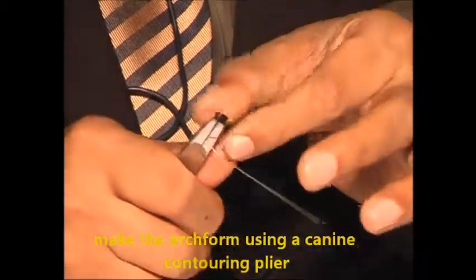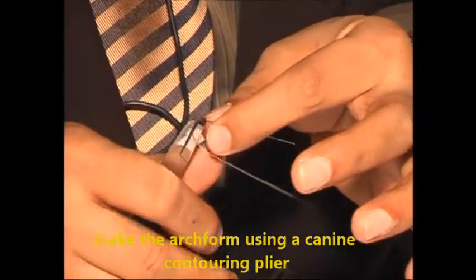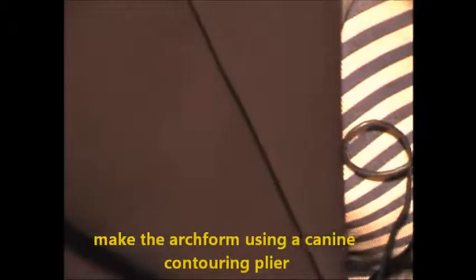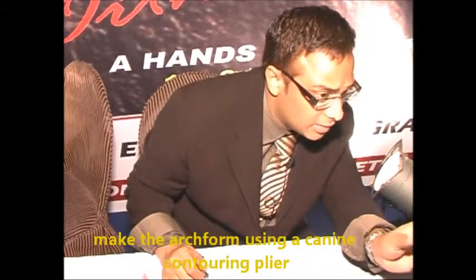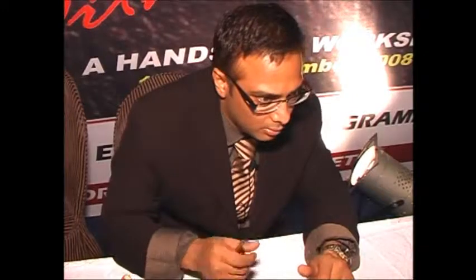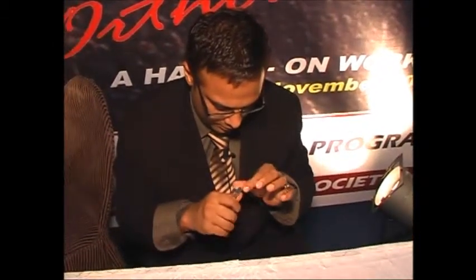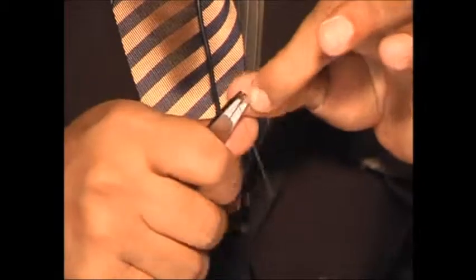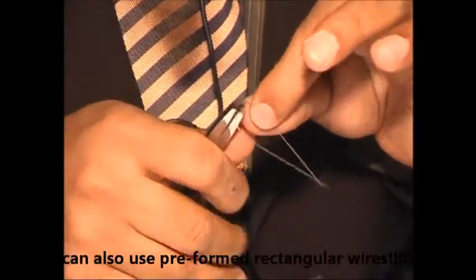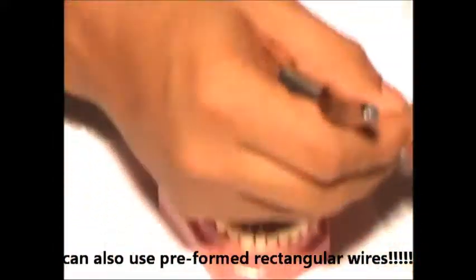Make the arch form using a canine contouring plier. For making rectangular wires, you get a turret which is really very small — it makes a very constricted arch. The turret you use for labial is very small; you get a turret also, that is available with OMCO. Or else you can also use preformed rectangular wires.